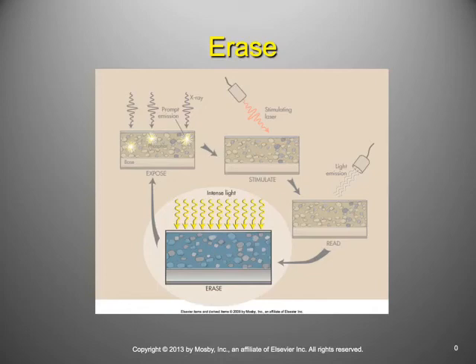One thing worth looking at, again, just in terms of these different emission spectrums, is if you look at page 288 in your textbook, you have an illustration of how the solid state laser or the gas lasers are discrete colors. They are specific colors, red or orangish, but the emission of light from the PSP is a spectrum of light energies, anything from green to kind of purplish.